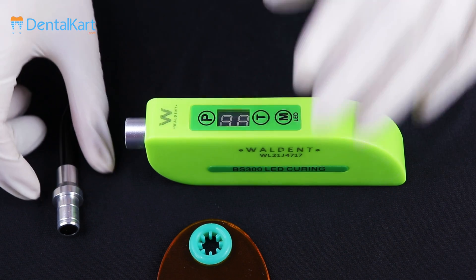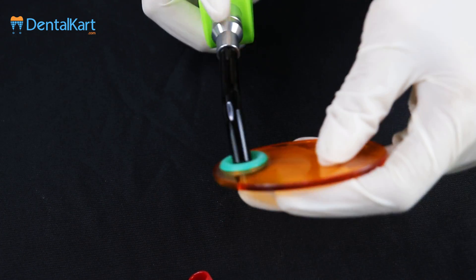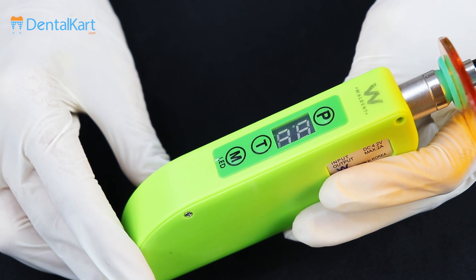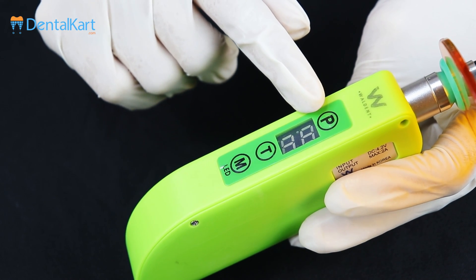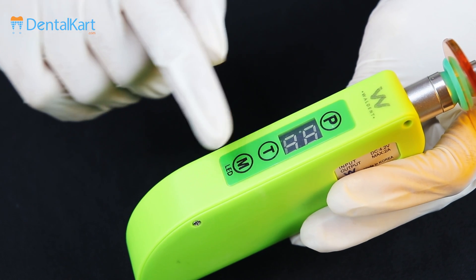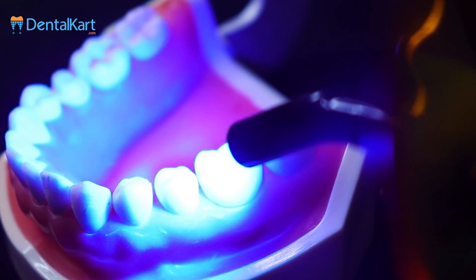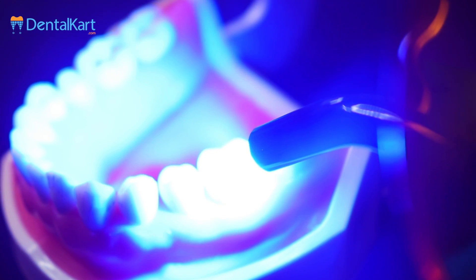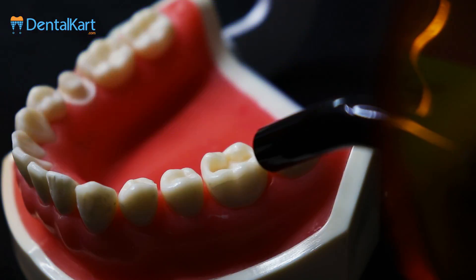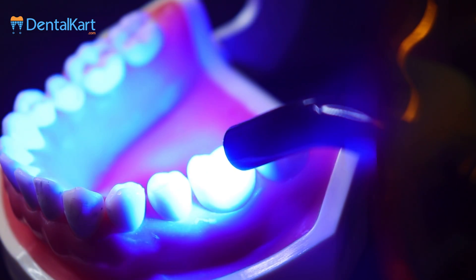Attach the fiber probe on the top of the main unit and then connect the light shield. On the front face of the main unit, from the top, there is a power button, then the LED display, followed by the time setting button and the mode setting button. It has three working modes: strong, flashing, and gradually strong.